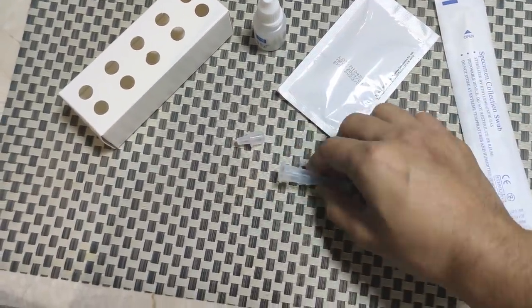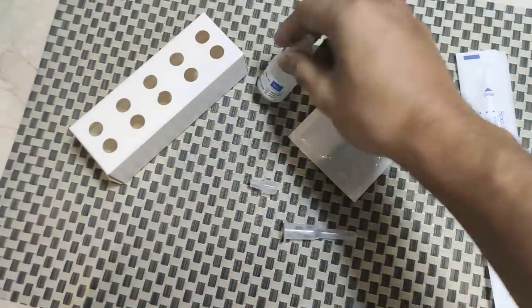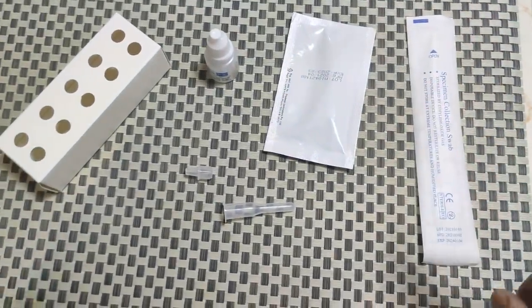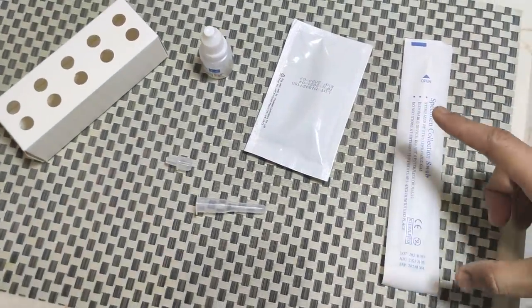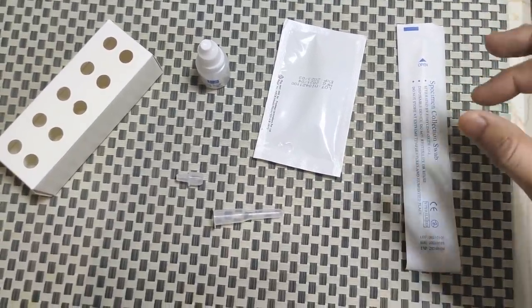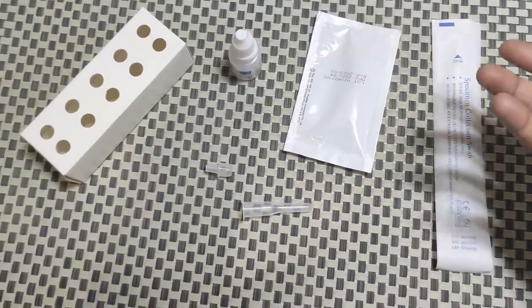We have this Eppendorf, we have the cap, we have this Eppendorf holding stand, we have this buffer, we have this test kit, and we have a swab. Remember when you are doing the test, do not touch the swab end — the head of the swab — with your hand. If possible, put it away from your hand and try to wear gloves.